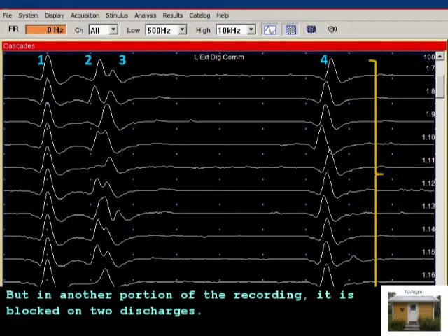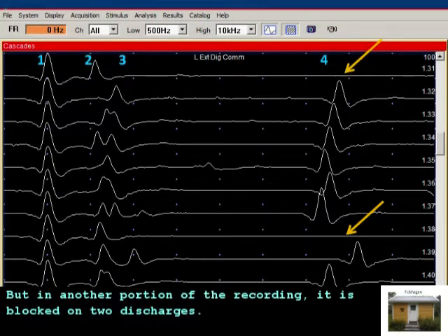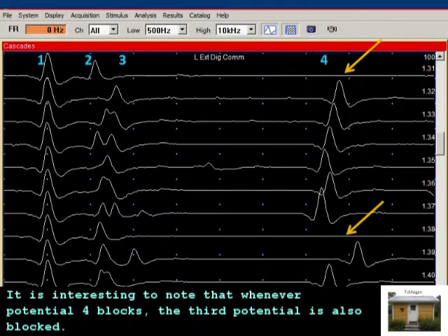But in another portion of the recording, it is blocked on two discharges. It is interesting to note that whenever potential 4 blocks, the third potential is also blocked.